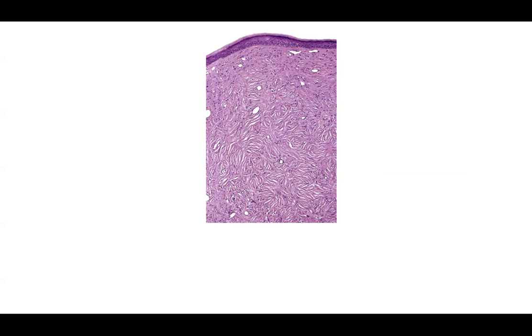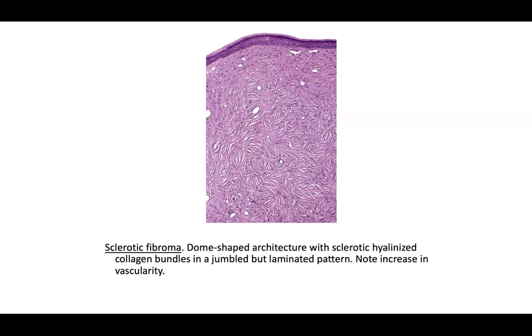Sclerotic fibromas are associated with Cowden disease. Instant recognition earns you a point on the exam. Features include a dome-shaped architecture, sclerotic hyalinized dermis with collagen bundles in a laminated or slit-like pattern. Some describe it as a plywood pattern. You can also see some vascularity. Differentials include late-stage erythema elevatum diutinum with little inflammation, but look for vascular destruction and remnants of vasculitis elsewhere on the slide.